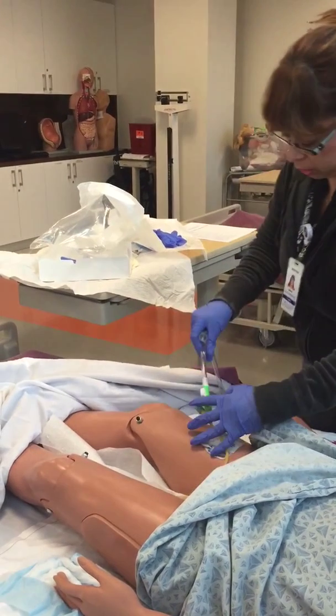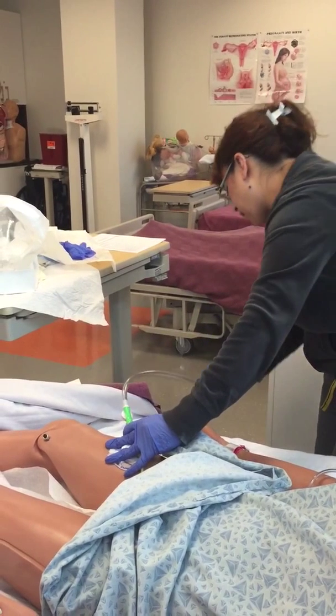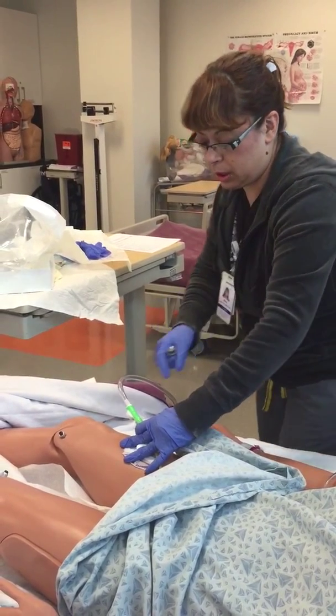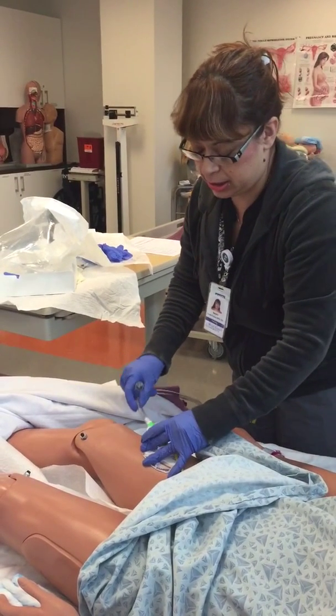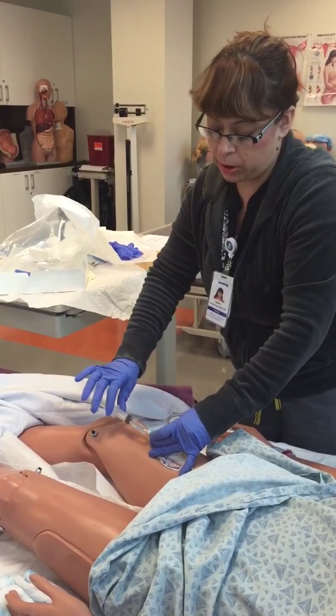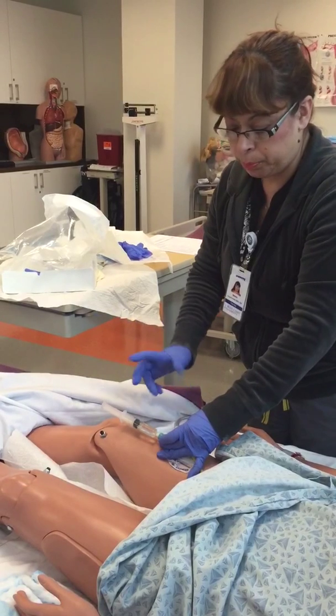And you want to get rid of the urine that's here in your bag first. You want to empty that and discard it in the toilet. Make note of how much is in there and what it looks like. Put this in. Let this flow on its own. You don't want to force it out. Just let it flow on its own.